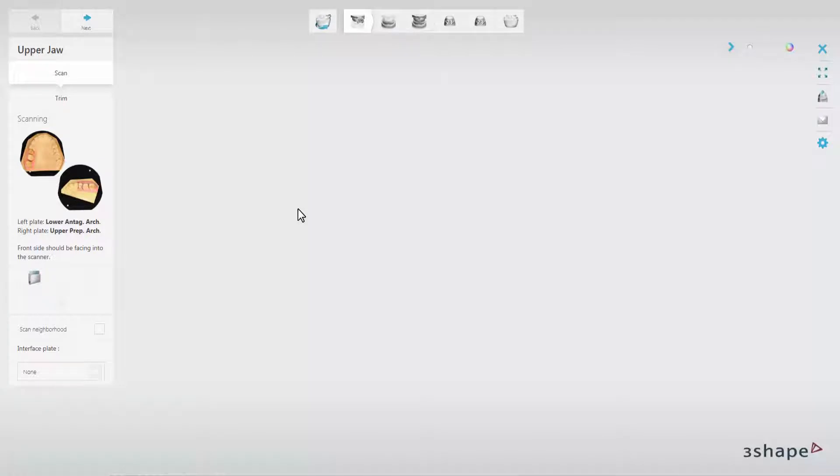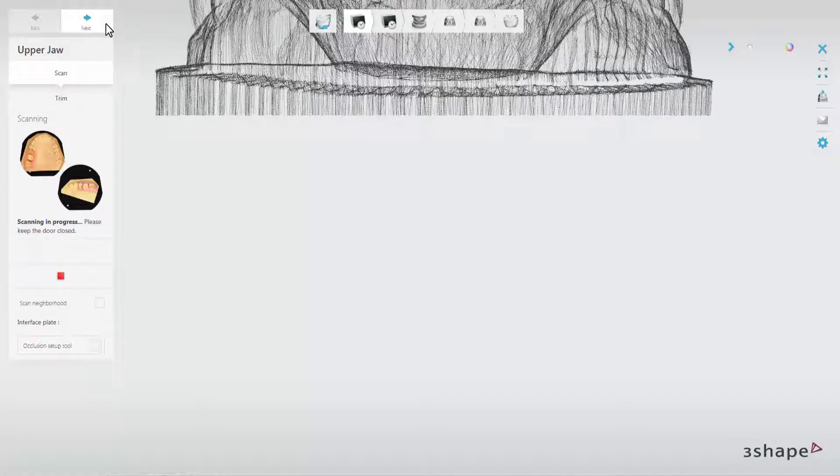The Scan-It Dental software will open. In the Interface Plate drop-down menu, choose Occlusion Setup Tool and click Next to start the scanning process.